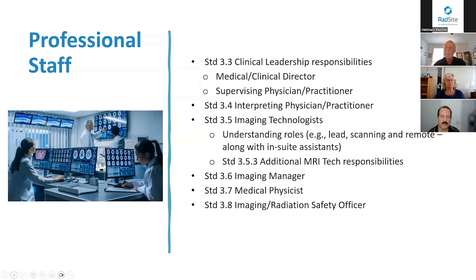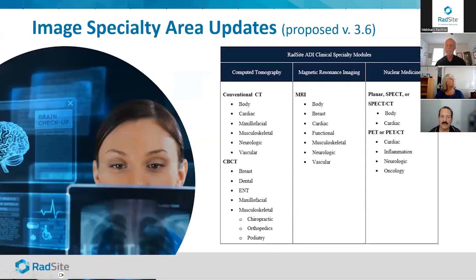Yeah, it's a good question. I think one of the many challenges with cone beam CT is the way in which radiation and exposures are measured are significantly different in comparison with non-cone beam, or let's call it conventional CT. The other issue is from a physics perspective of determining image quality.